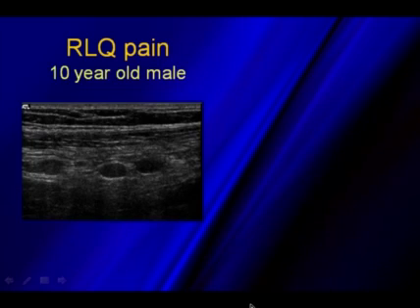This is a 10-year-old male patient that came in with right lower quadrant pain, and in scanning the right lower quadrant, we could see that he had enlarged lymph nodes.